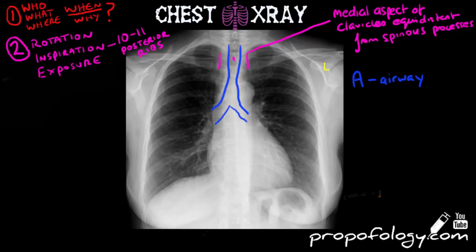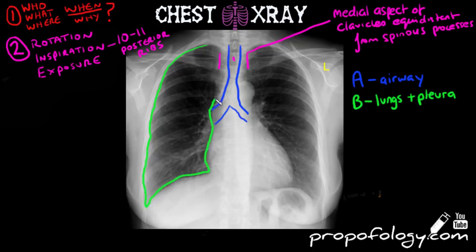Moving on to B, you're going to trace the lung fields and look at the pleural spaces as well. You're going to look and see if the lung markings go all the way to the lateral or side aspect of the rib cage, make sure there's no collections in the distal portions, and make sure there's no collapse of any segments of the lungs. Make sure there's nothing obvious in any of the lung fields that doesn't look the same as the other side. Of course the patient can have bilateral pathology, but it's good to compare each side and contrast.